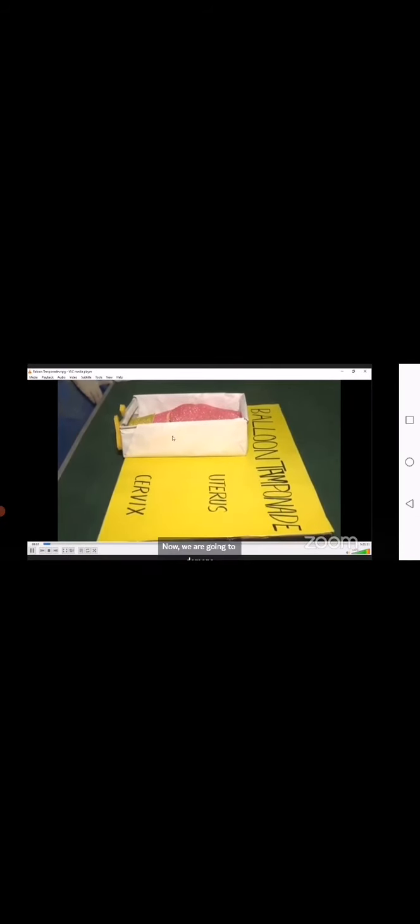Now we are going to demonstrate balloon tamponade, which is a very effective and useful technique to treat postpartum hemorrhage when other pharmacological measures fail to control PPH. Its main principle is to exert tamponade effect on uterine walls to stop bleeding in non-traumatic postpartum hemorrhage.